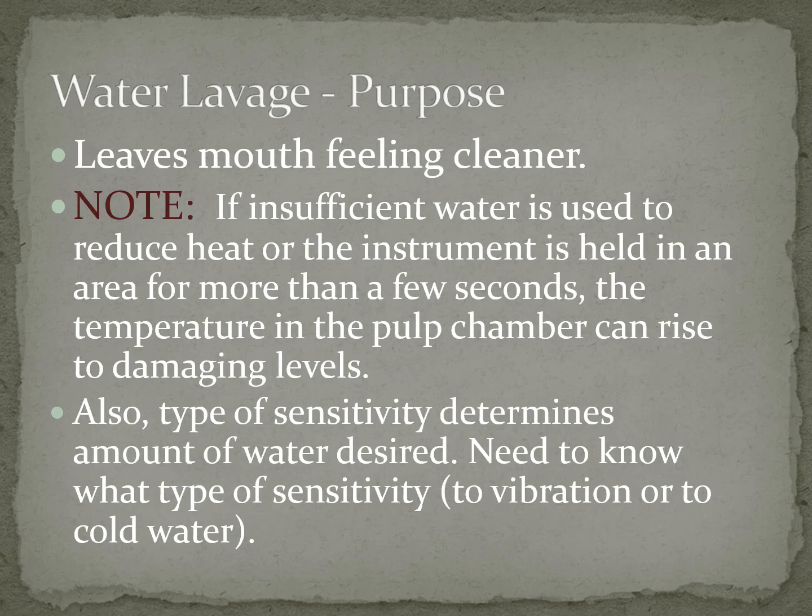Okay. It also leaves the mouth feeling much cleaner. So a lot of patients love the ultrasonic cleaner. Now, some patients are going to hate it, but in general, most patients do like it. So if insufficient water is used, though, to reduce heat, or the instrument is held in an area for more than a few seconds, that temperature can rise in that pulp chamber, and we do not want it to damage it. So we need to constantly keep moving.